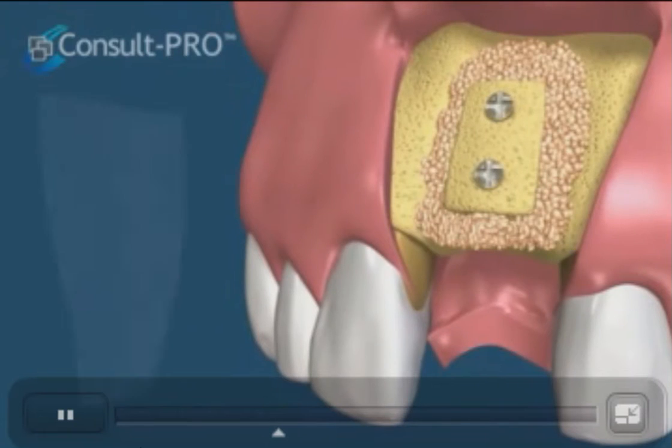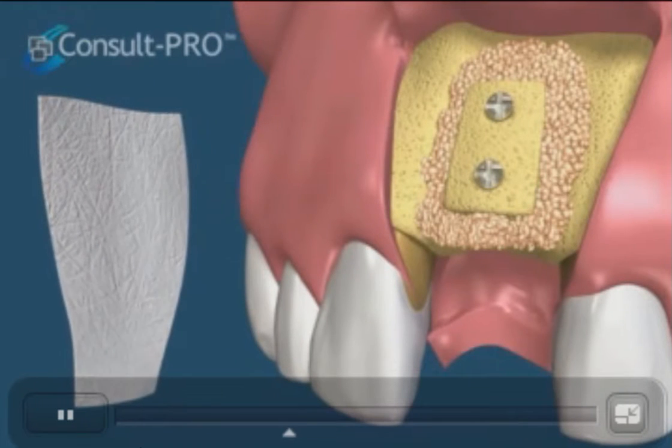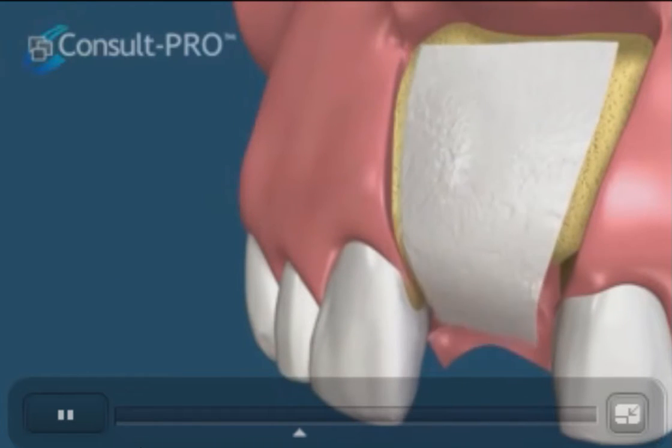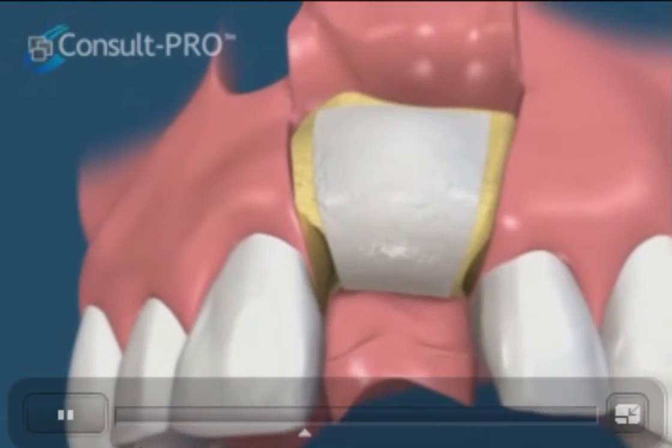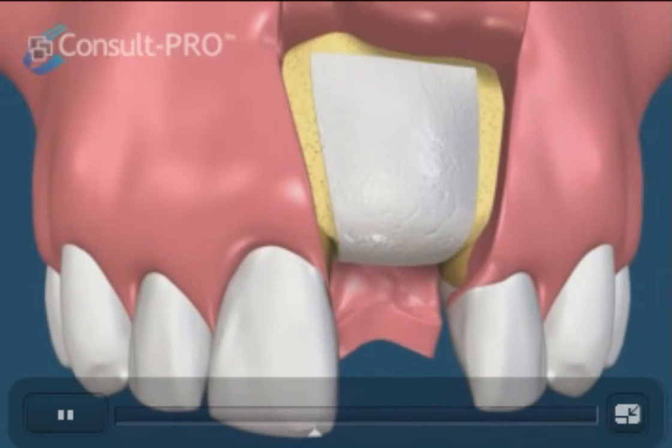If deemed necessary, we can then cover the area with a resorbable membrane to further help with the healing. The flap is repositioned and sutured into place.